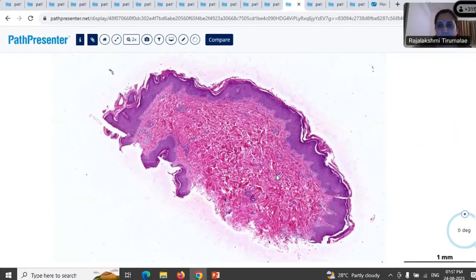Yes, please continue. Ma'am, can you hear me? Yes, we can hear you. Please go ahead. Ma'am, I'm so sorry. I'm just a first-year resident. I'm trying to present the picture you have given me, but I'm not very sure.